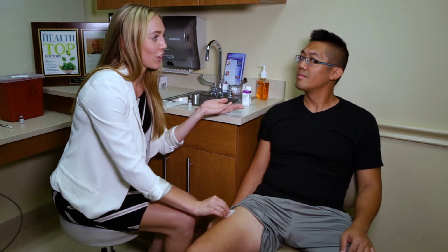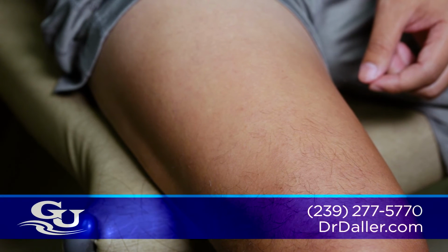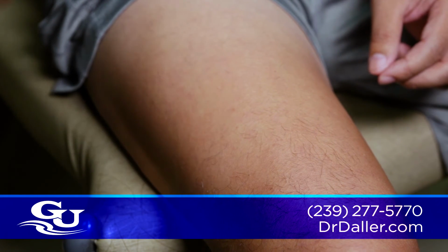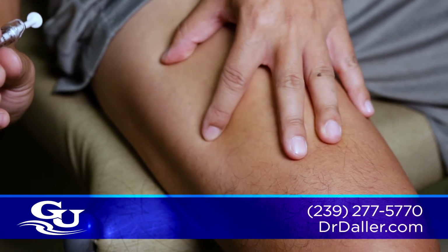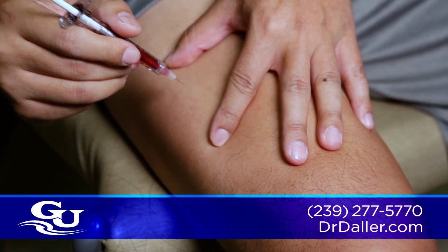And we have Mr. Long here, who is going to be our demonstrator for a self-injection. It's very important that you are in a comfortable seated position to make sure that your muscle is not contracted. Next, you want to hold your syringe like a dart. Find the area that you would like to inject on your leg and hold your fingers to where your skin is tight. Next, hold your needle at a 90-degree angle to the skin and insert into the thigh.